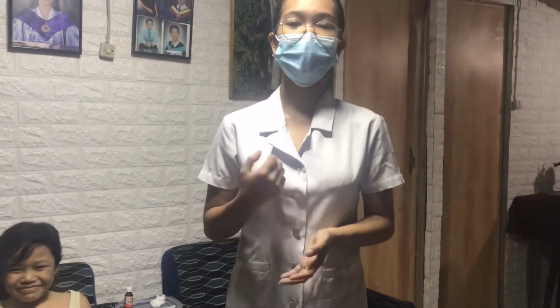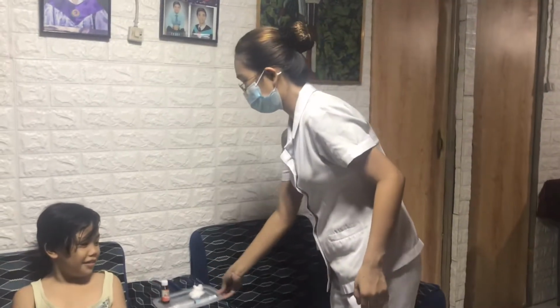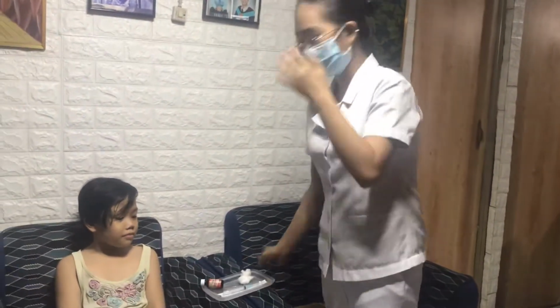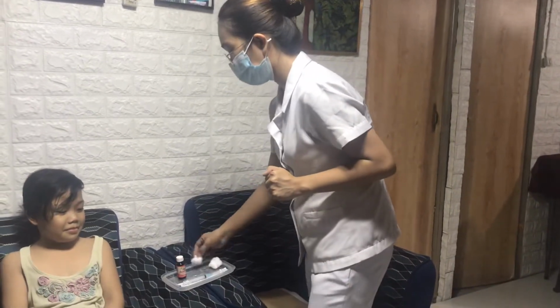Next, arrange the medication card on a hypodermic tray with the corresponding drug. The rationale for this is that organization and planning result in economy of time and effort and minimize confusion. This is my hypodermic tray. I already prepared the materials that I will be needing in administering this medication.